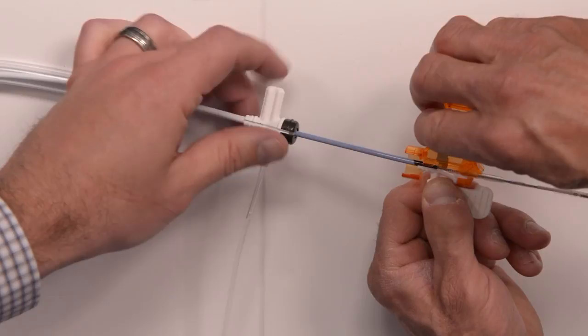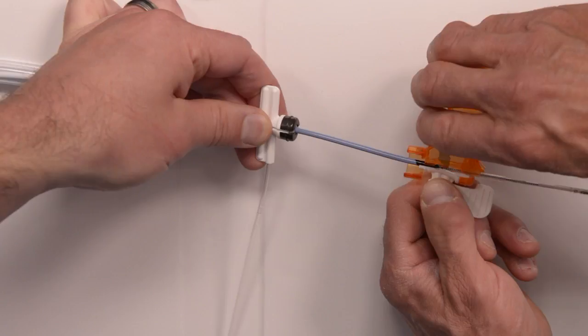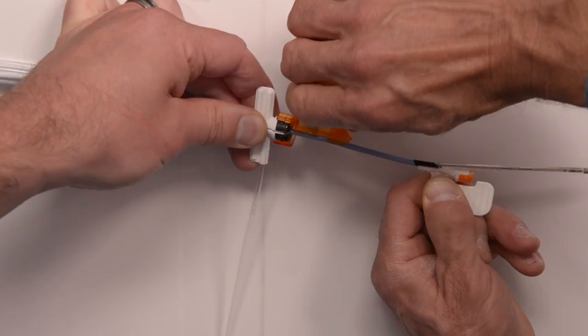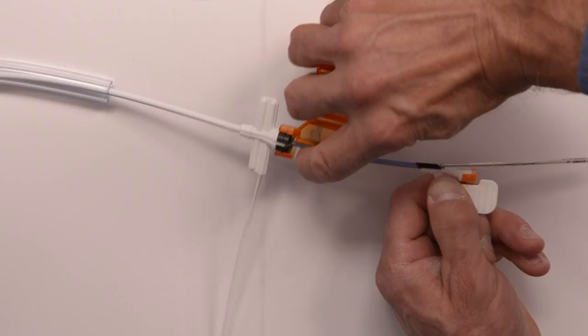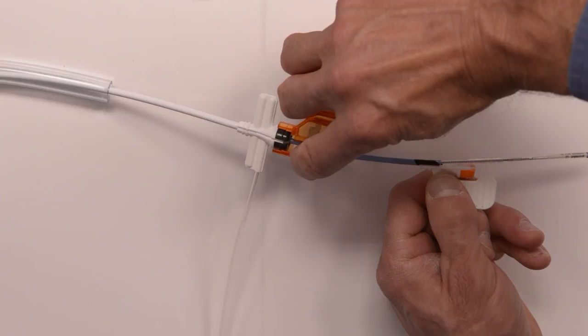With just slight pressure to keep this straight, I'm going to slice all the way forward so the flange mates with the hub of the CSG. The first move I make from there is to take my index finger and place it over the LVI and hold it against the slitter. That really adds to the stability of this system—not just a little bit of pressure but actually put some pressure on there to keep it there.